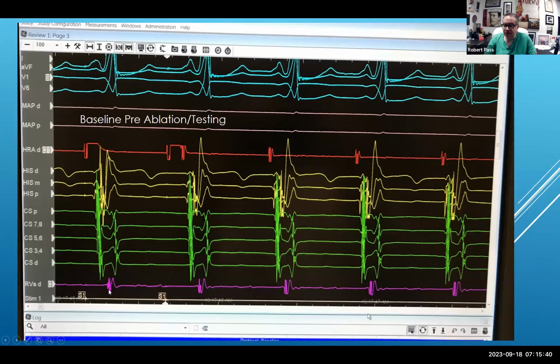And then finally, we have the electrogram from the right ventricle. And this is also interesting to see how the right ventricular signal is so much earlier than any of the CS pairs, including the proximal CS, which is, although in the posterior septum, still relatively close to the AV node. So again, suggesting that there is some kind of eccentric AV conduction, in this case via an accessory pathway or WPW. Does that make sense? Any questions about that? Okay.